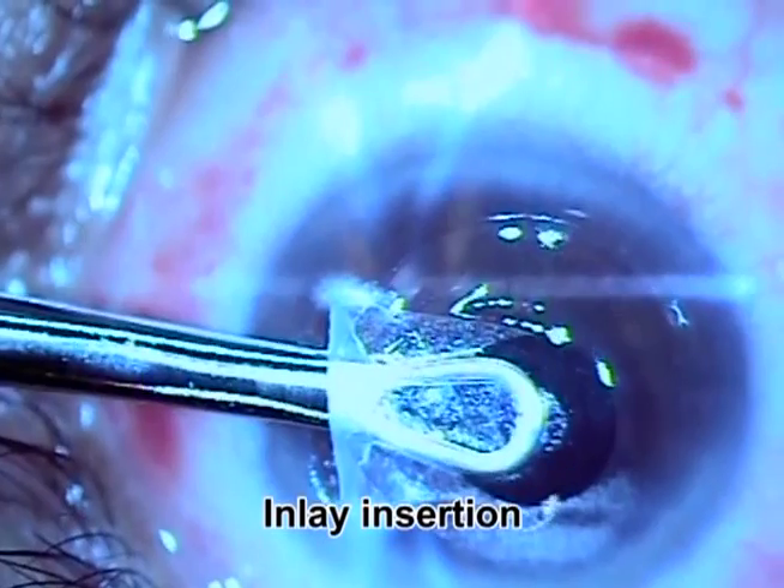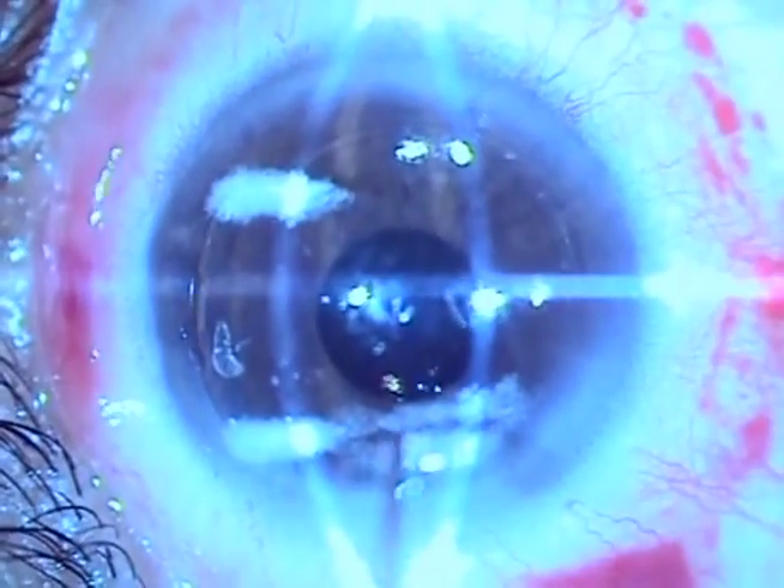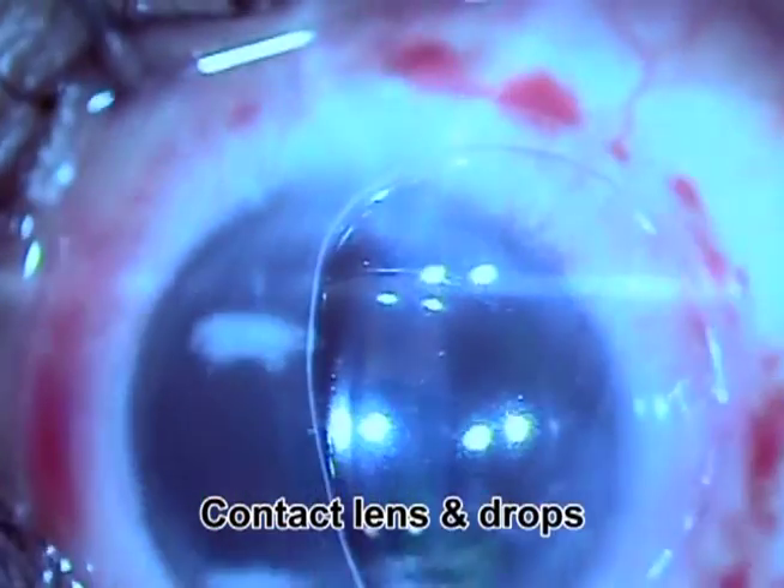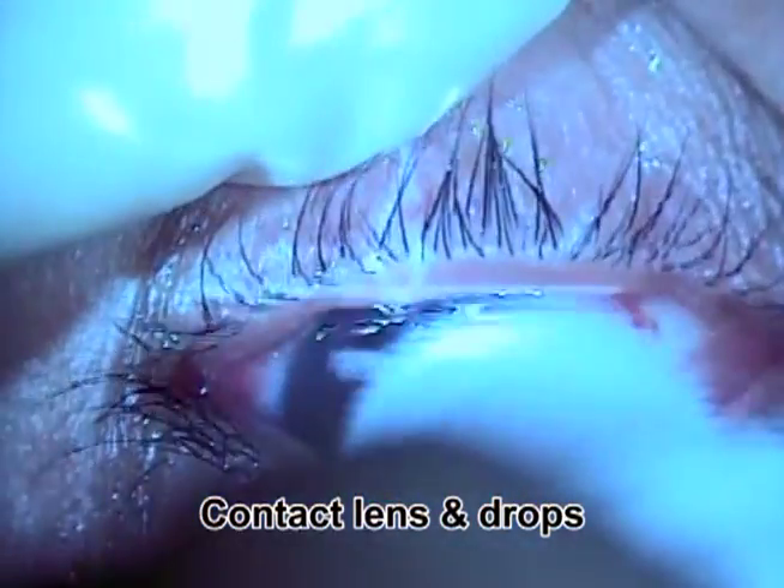Then we prepare the inlay and, under direct visualization, place the inlay in the desired position. A contact lens is applied and drops are given. Surgery is complete.